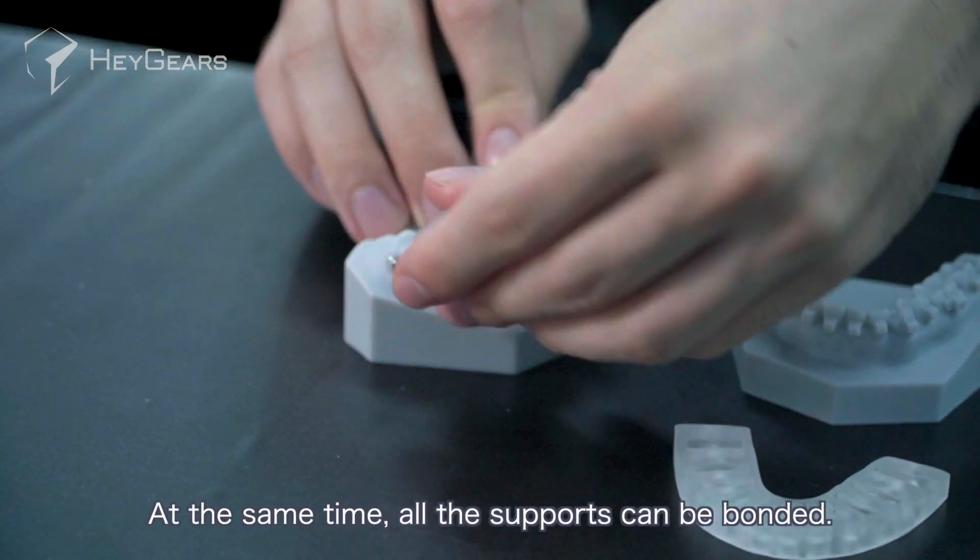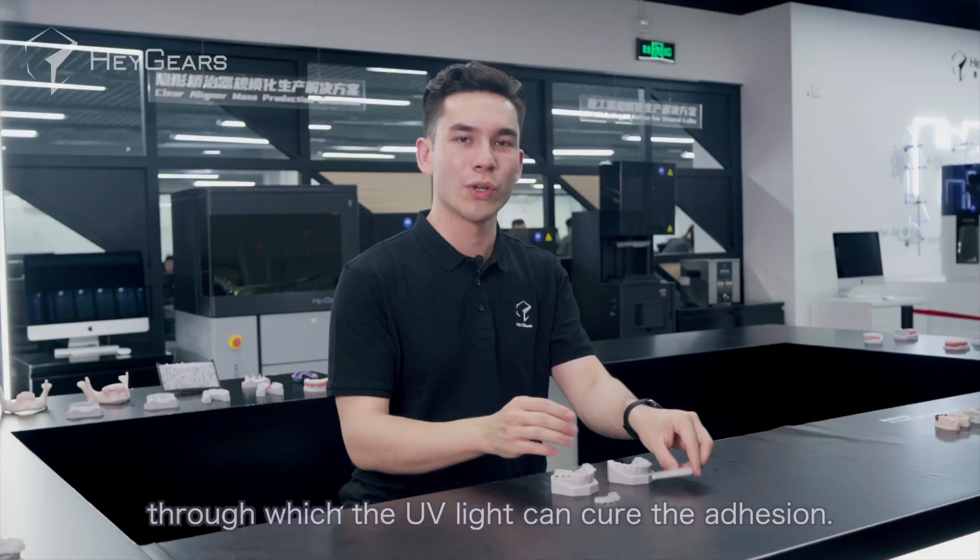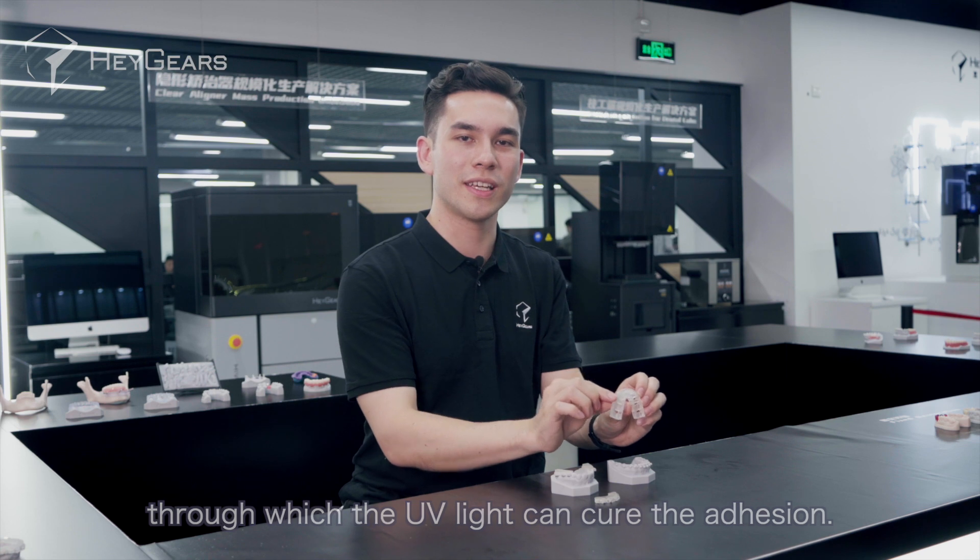At the same time, all the supports can be bonded. In addition, this is a translucent material through which the UV light can cure the adhesion.